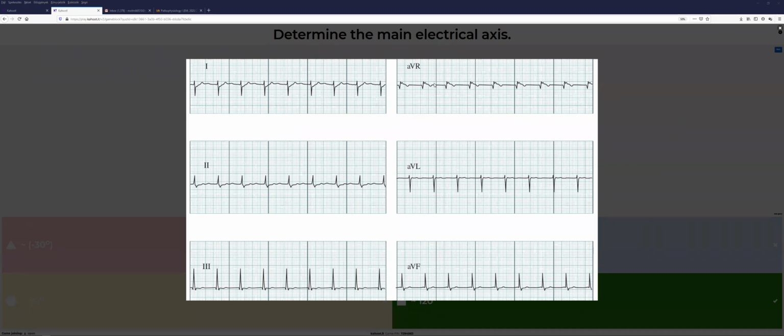So it means that we are going to be perpendicular to AVR. That means AVR is located at 210. Which angle is perpendicular to 210? 110? Yes, because AVR is 210. 30? No. 210 minus 90 makes? 120, I guess.